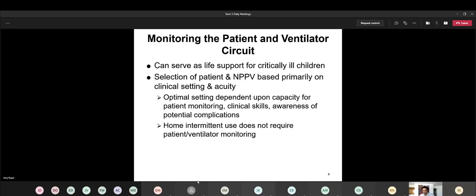And the last point here, sometimes the babies or the children are going to be discharged home with this equipment, which means that at the house, you're not expecting mom and the rest of the family, or whoever the caregiver is, to be proficient with this equipment and know how to troubleshoot. Now, if you're the home care therapist, you are going to help them do some basic troubleshooting.